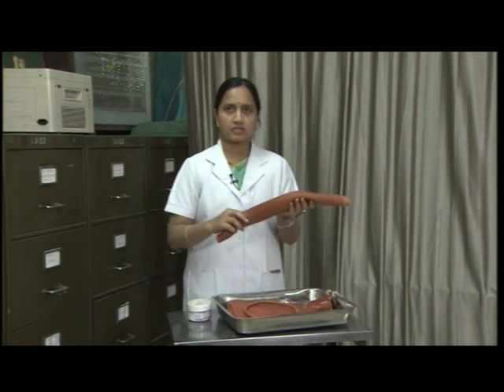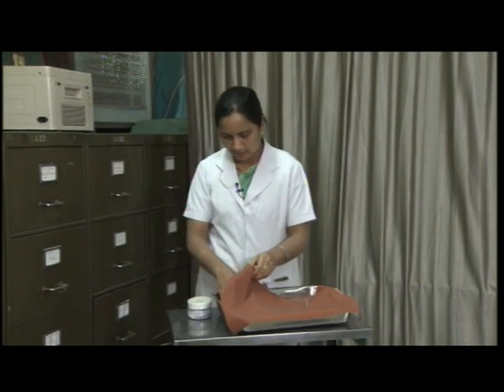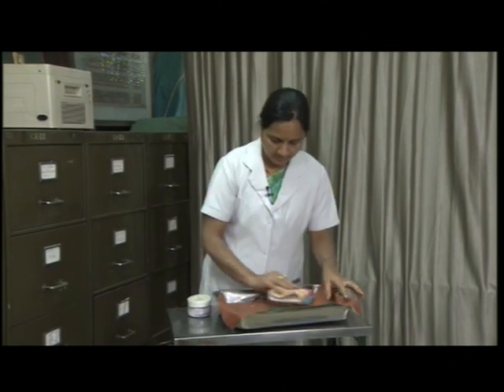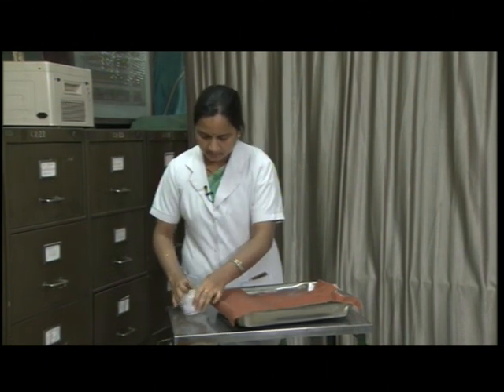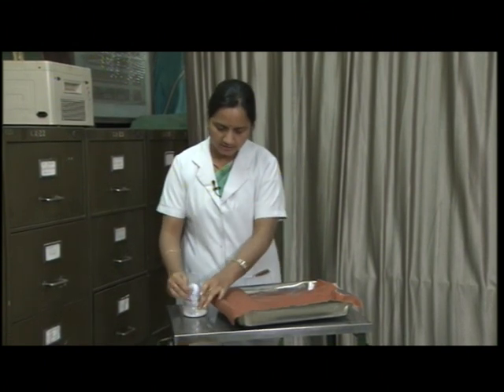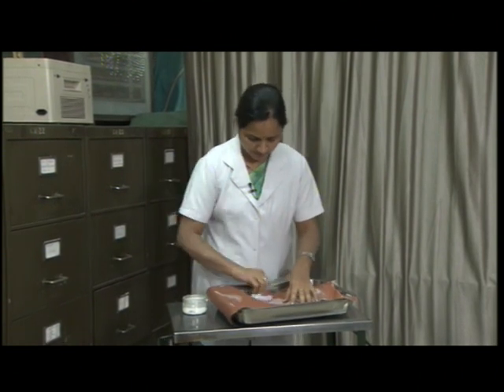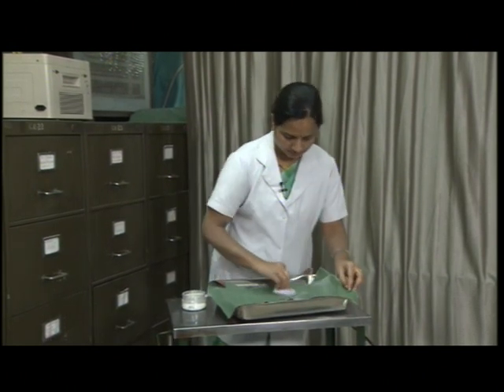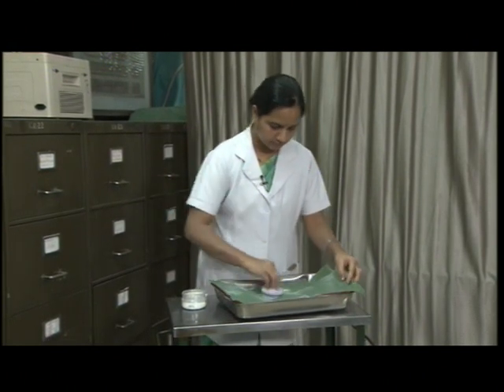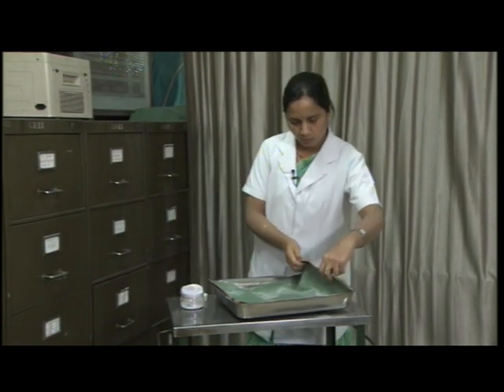For Macintosh, after washing the Macintosh, dry the Macintosh properly. Then sprinkle some powder over it on both sides. Then roll it.